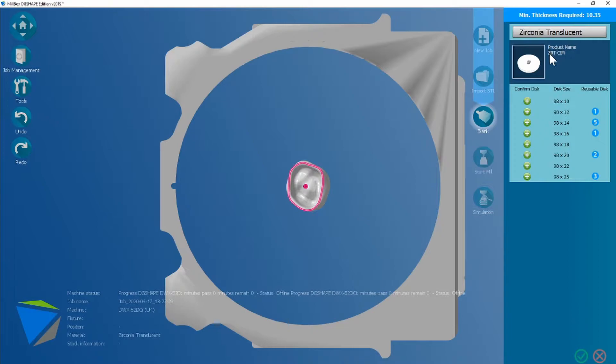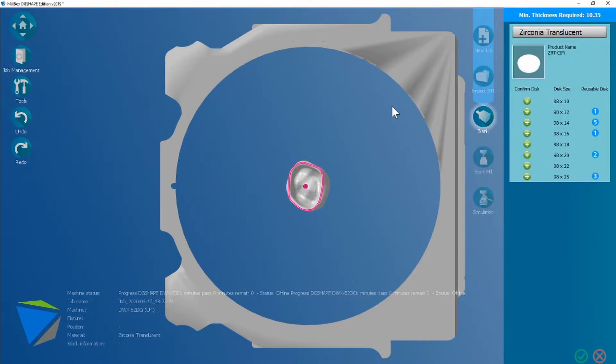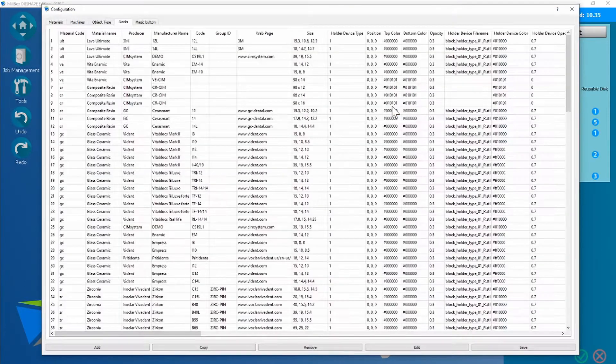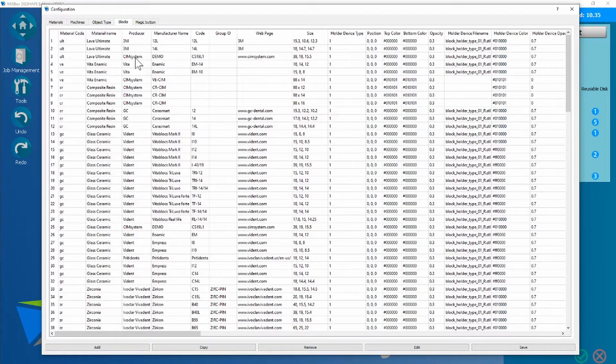So it's worth taking note of this code here, zrt-cim. We're going to press ctrl-d and open up the configuration menu.